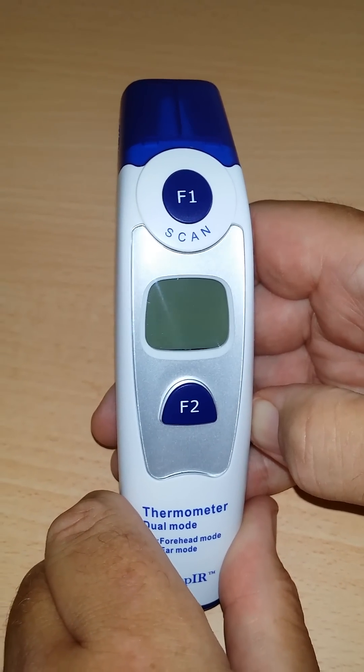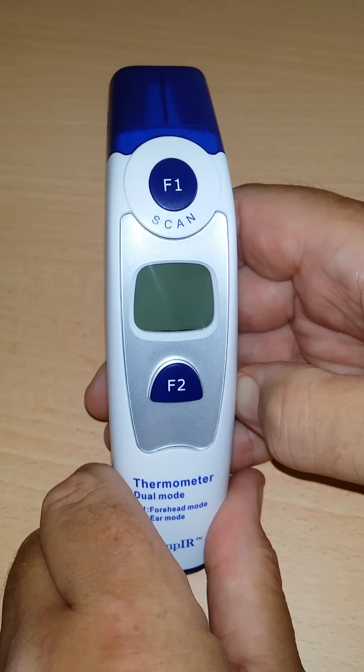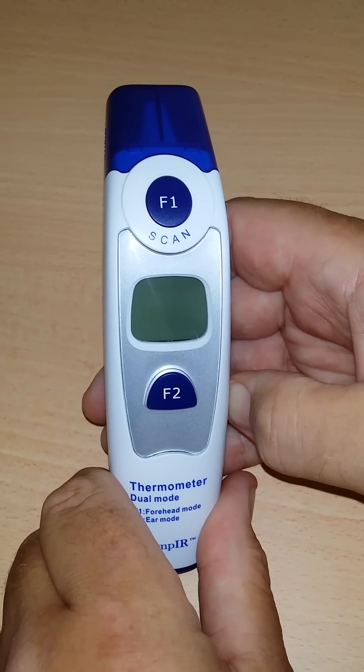All you need to do to revert back to centigrade is just follow the same instructions and press the F2 button to change it back to centigrade.